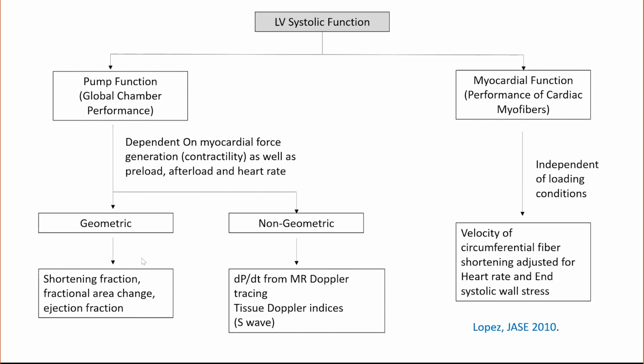They're great. They're easy to measure. They have a lot of reproducibility. The only problem is they're all load dependent, which is fine for our case because of the utility of FOCUS. We can do these things repeatedly over the course of illness, so you can see how the patient is trending. And we are also aware of every different organ system or the whole body's current state to make an assessment.